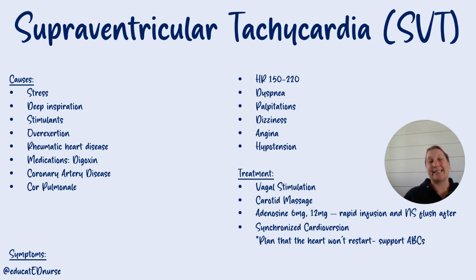If you don't do adenosine, you can do cardioversion. Cardioversion is similar to defibrillation. However, it's a much smaller dose. You're looking at about 50 to 100 joules with cardioversion. And when you set up your monitor, you have to set it to sync, not defibrillate. It has to be on sync. It's synchronized cardioversion. And when it syncs, it's looking for the top of the QRS, so it knows exactly when to shock the patient, so it can hopefully again restart.